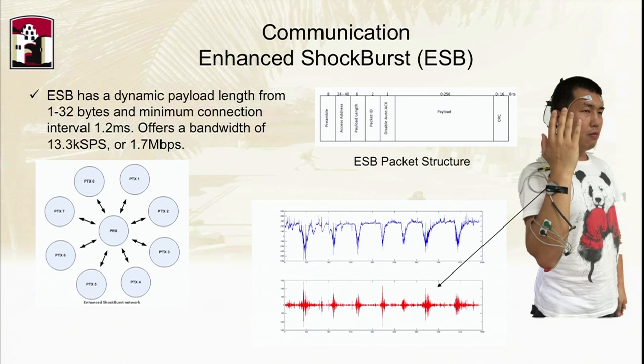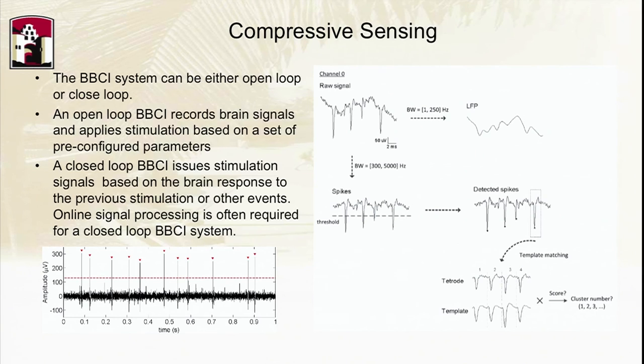As I said, we have multiple sensors. We're currently shipping these sensors to other research institutions for various purposes. We're giving them out to people studying rehabilitation, and to people studying brain recordings. And these devices, this is one of the students in my lab, never implanted anything yet, but all external tests are very successful.